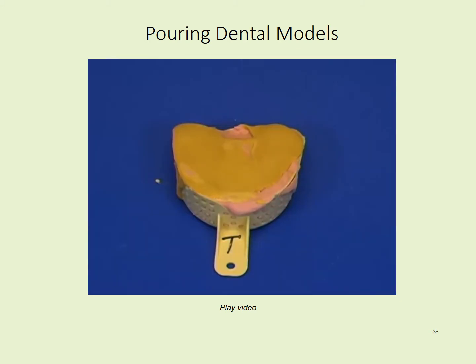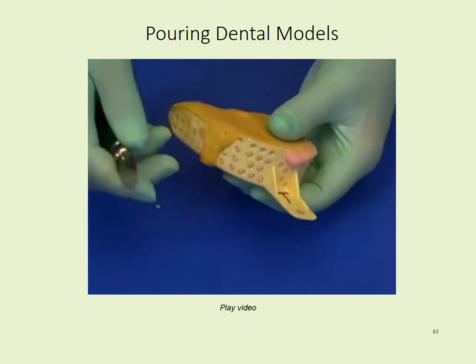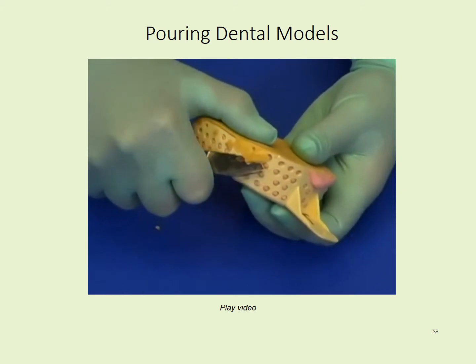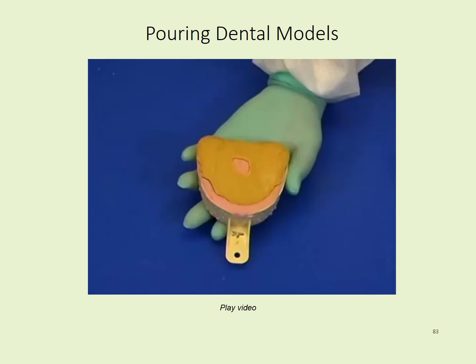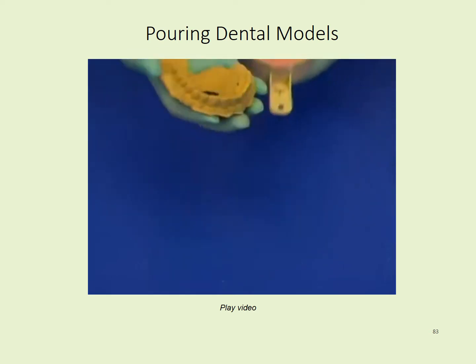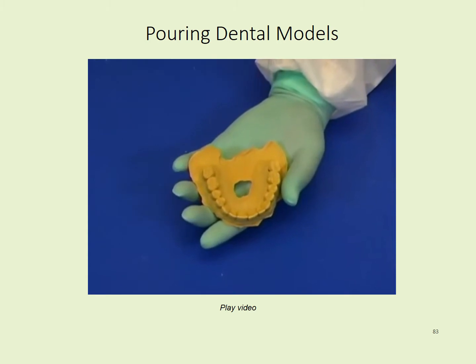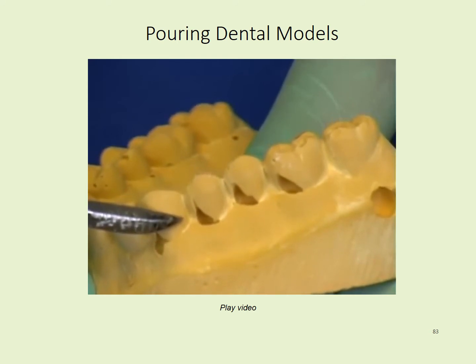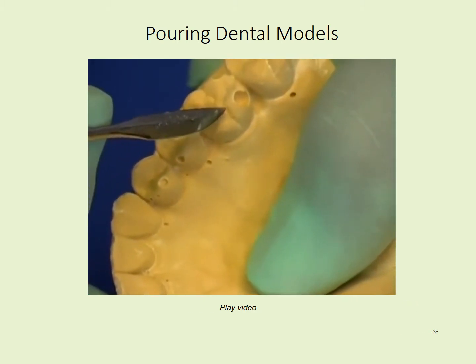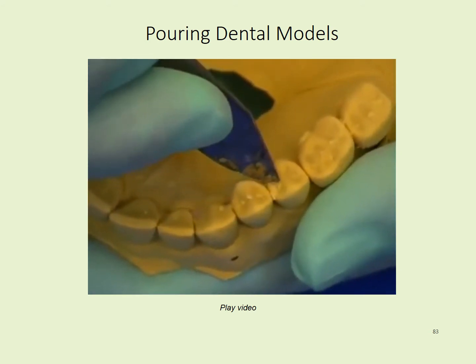Remove the stone model after it is cool to the touch, at least 45 minutes after pouring. Before removing stone from the alginate, take a lab knife and clean excess stone from the tray. Unmold the impression carefully to avoid breakage. Inspect incisal and occlusal edges for voids and excess blebs of stone. Air bubbles incorporated into the stone during pouring will result in voids in the final stone model. Remove blebs of stone with the lab knife.